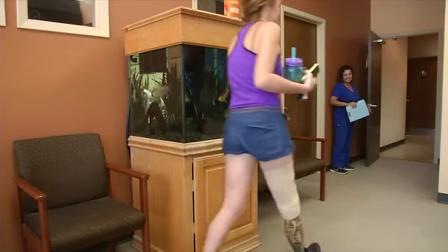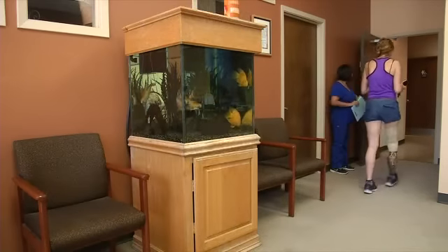Even though I'm missing a limb, I'm whole if I get to walk out of here with the test leg today. A few hours later, Mel emerges with a new test leg and a new task.